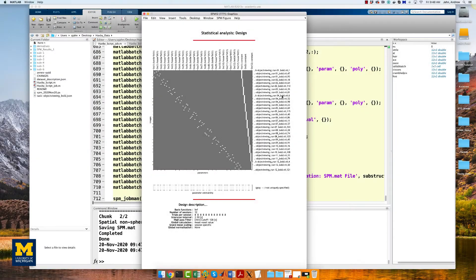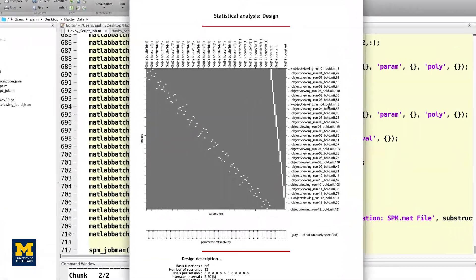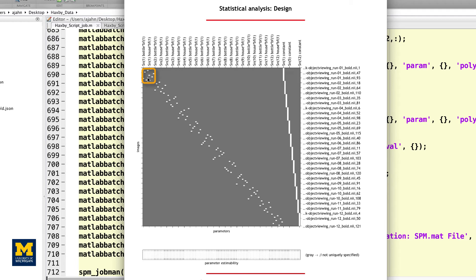When the script is finished, you should see a design matrix that looks like this. Each run should look like a separate square with the tiny white squares within each run representing a block for each condition. Each of these blocks has been estimated as a separate beta map, which we will use as both training and testing data for our classifier.